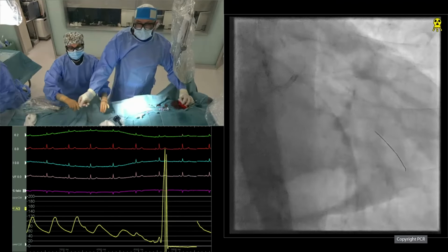Yeah. Sorry, Emanuele. We were discussing the next step because probably it's a good idea to make an injection and see how are all the branches. The patient has some chest pain, and we wanted to check how is the vessel. Okay. No worries.